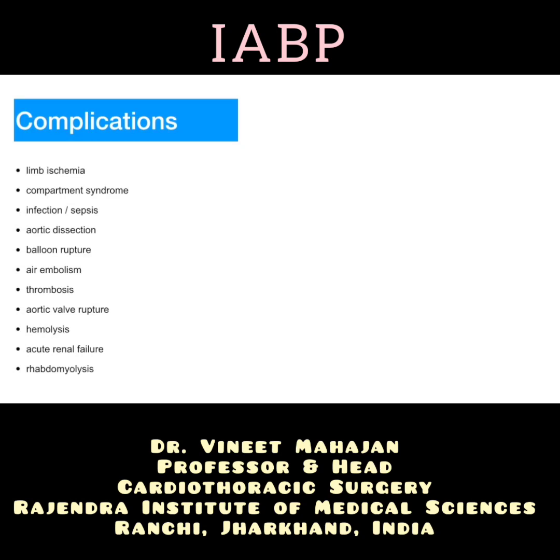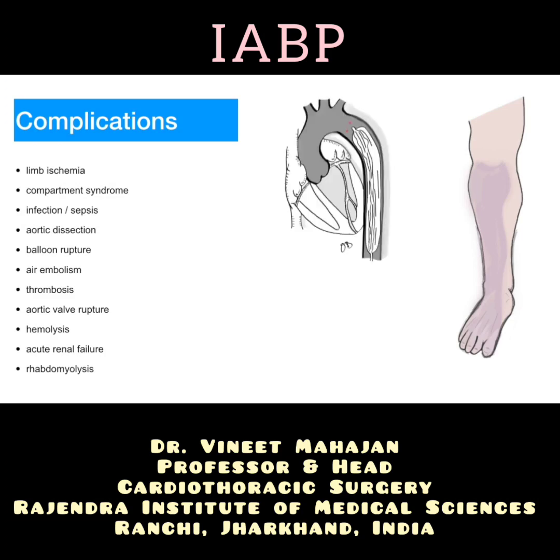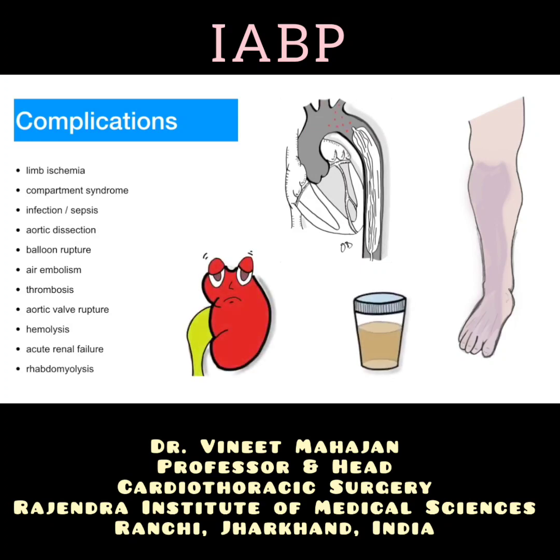Due to the invasive nature of the balloon pump, its usage is accompanied by a consistent risk of complications. Here's a list of some of the complications: limb ischemia, compartment syndrome, infection or sepsis, aortic dissection, balloon rupture, air embolism, thrombosis, aortic valve rupture, hemolysis, acute renal failure, and rhabdomyolysis. Balloon rupture, although it occurs rarely, may lead to entrapment if the diagnosis is delayed.